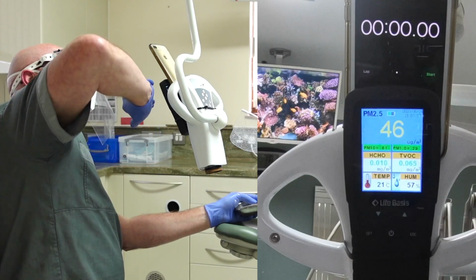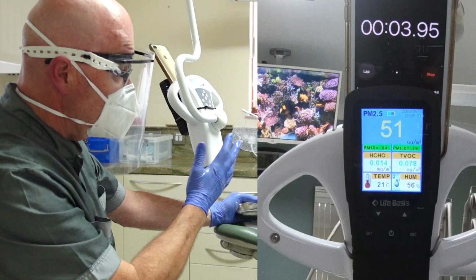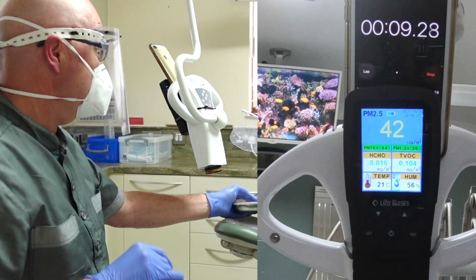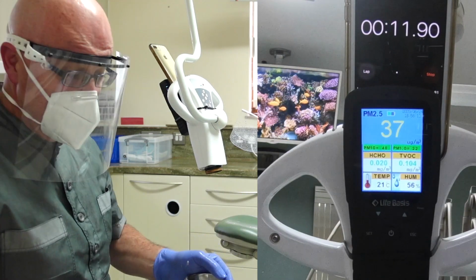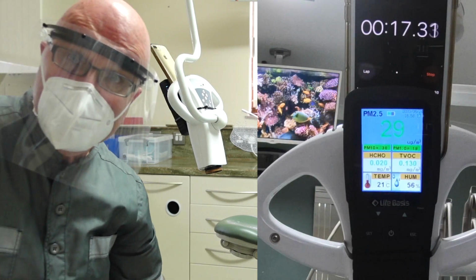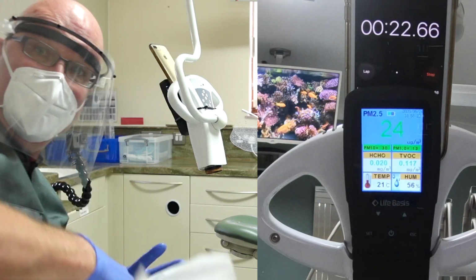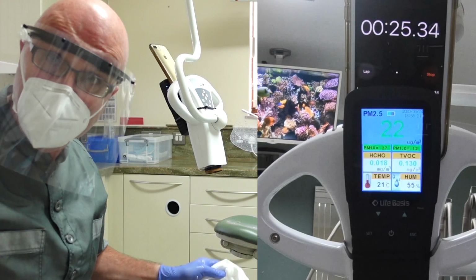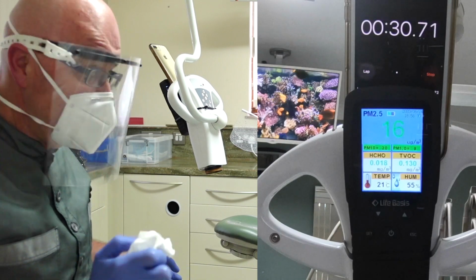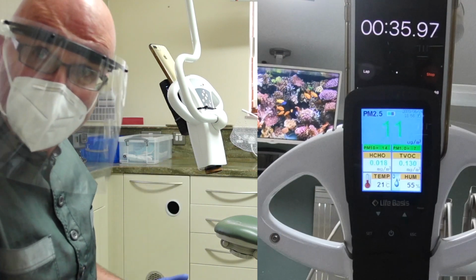Okay, I've been going for a good few minutes. We've got a bit of a reading there, but of course this was trying to be exaggerated, having this forward of the aerosol, so a fair distance away from the point of production. Don't know how fair that is, but as I said, I want to make this an extreme test for the DentalAIR. Nothing else is in effect at all, no open window, so hopefully if this shows a reasonable result, then maybe we don't have to freeze to death in the winter by pumping all that heated air outside.